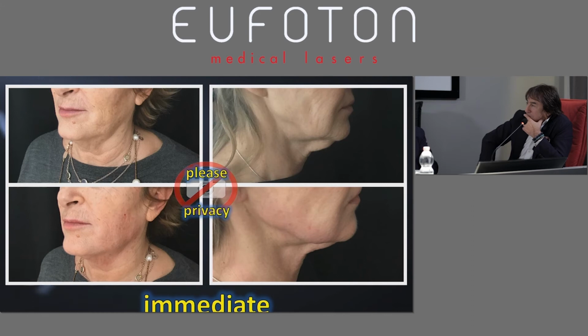My feeling is, also for the neck, sometimes you have a stimulation at the fascia level. It's not your target in theory, but we have some improvement of the platysmal band. And it's not the muscle, but also the containment system is good, is responsive, because you see some pictures where the platysma is very small, but we have no direct action on the muscle containment.